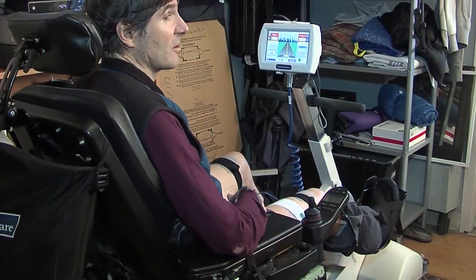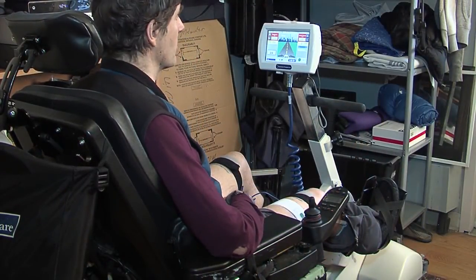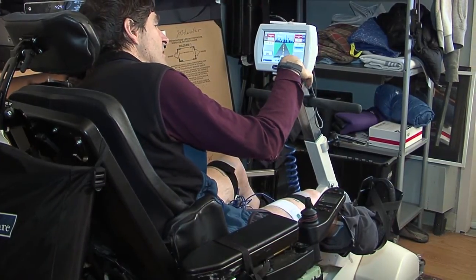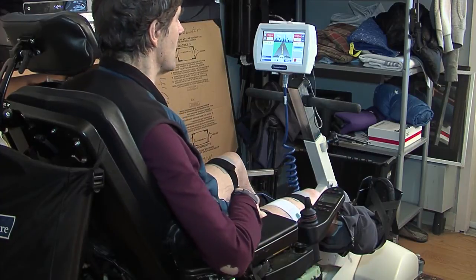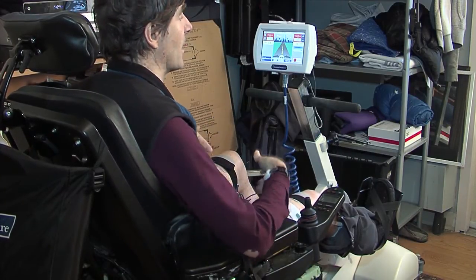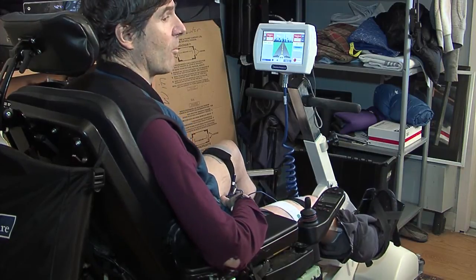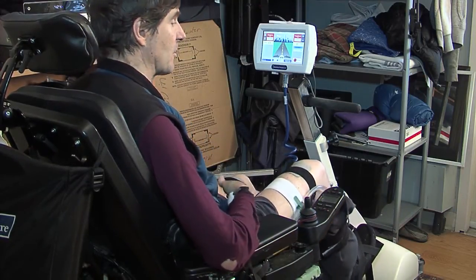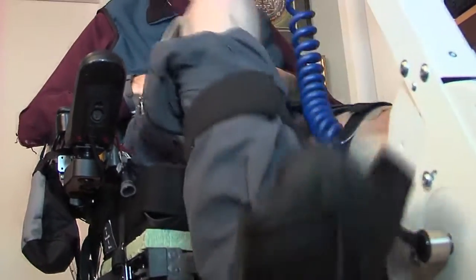I'm ready to start the exercise that I've programmed into this machine, and I'll do that by pressing the go button on the touch screen. The machine is going to slowly start to move my legs in a passive manner, which will warm me up for about two minutes. After that, the electrical stimulation will gradually come on and my legs will start to push the pedals on their own.